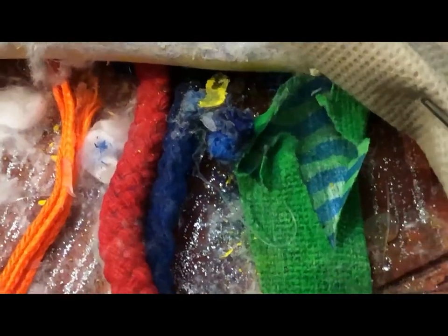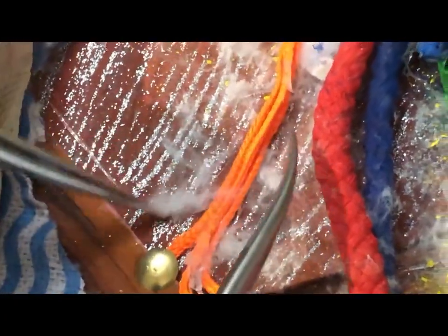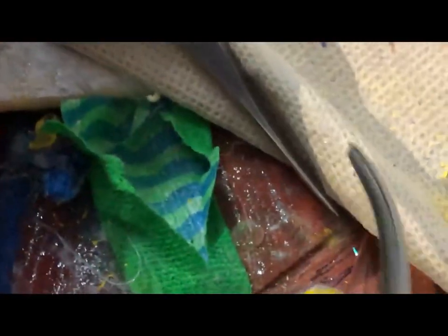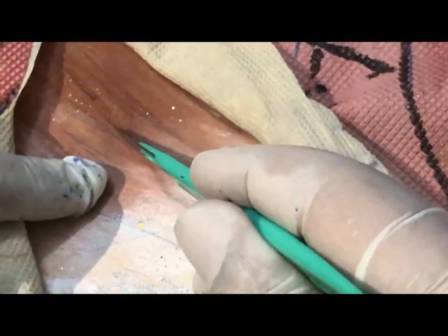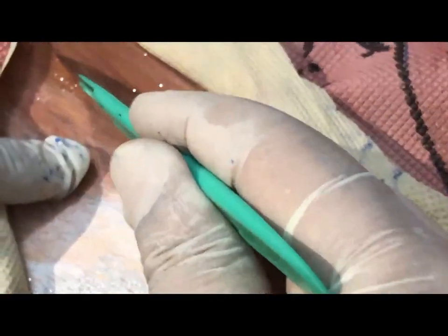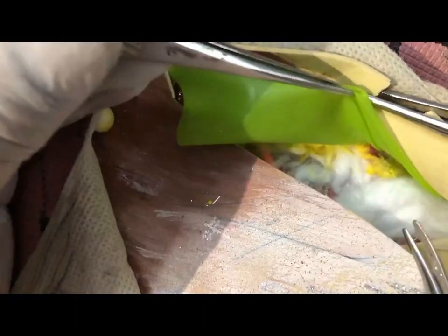The great saphenous vein and the medial part are shown. The specimen is usually sent for frozen section so we can decide about the iliac part. The rest is straightforward and one can proceed. Pectineus and iliopsoas form the floor — that's the femoral nerve, the most lateral structure, and then femoral artery and femoral vein. The incision is now made in the external oblique aponeurosis and the muscles are split or cut. Once lifted up one can see the peritoneum and the fat, which needs to be pushed up to expose the retroperitoneum.